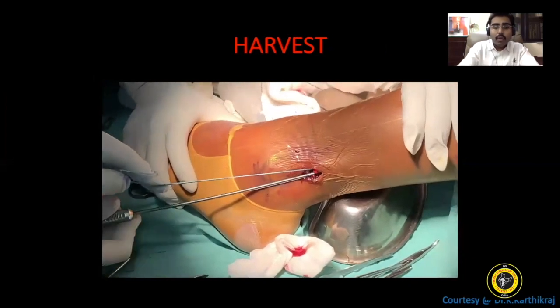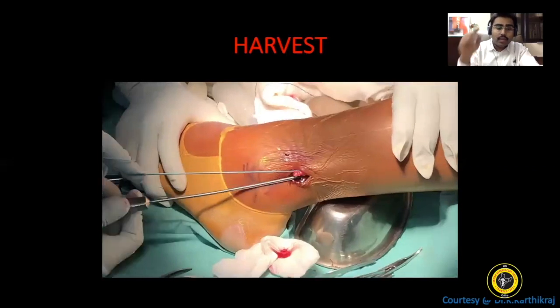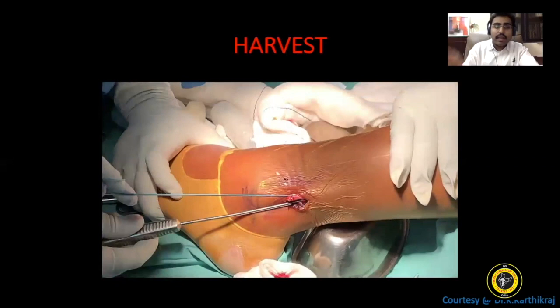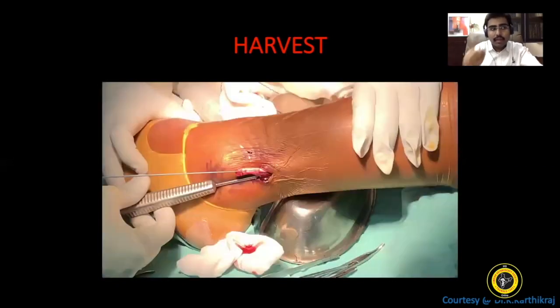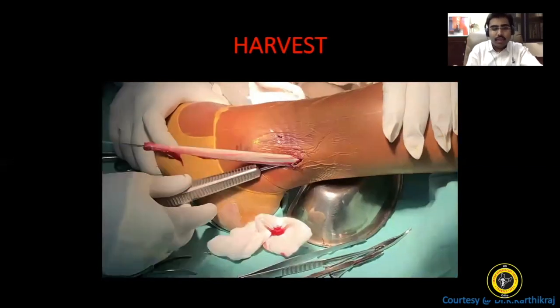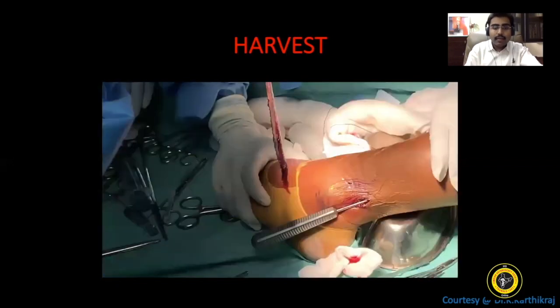The other important thing is the upper limit. I go around 4 to 5 centimeter below the head of fibula to avoid any nerve injury. The other technique I use is I ask my assistant to place the hand there, so I make sure that my tendon stripper does not cross the limit. And this is how a nice, fleshy, bulky tendon looks after a good harvest.